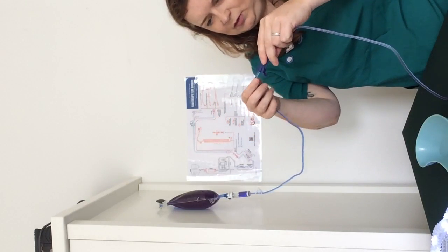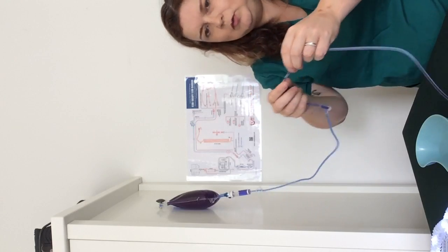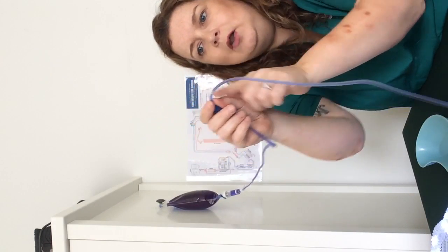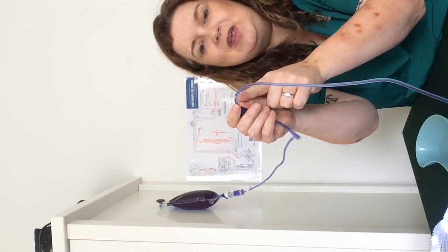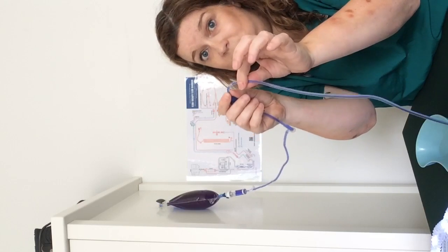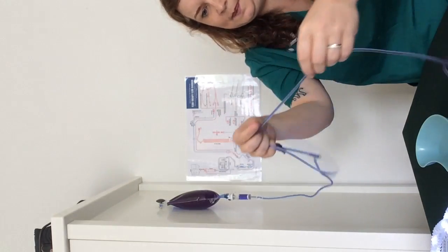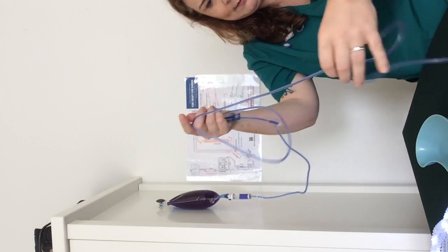There's a little sneaky one behind the regulator — you can just see it there — and I would class this as significant, because it is slightly longer than the width of the giving set. That's what we class as significant, so I'm going to need to get rid of that one, but it's going to come out anyway.